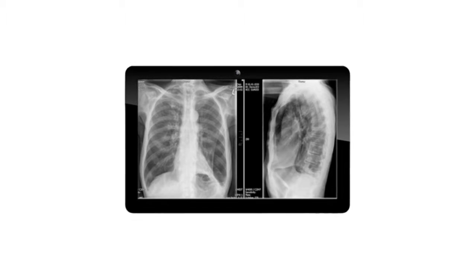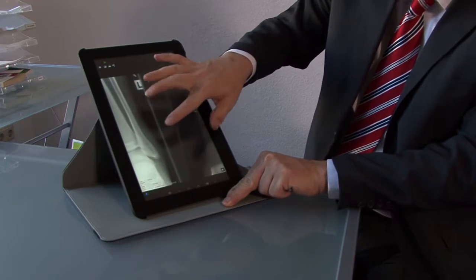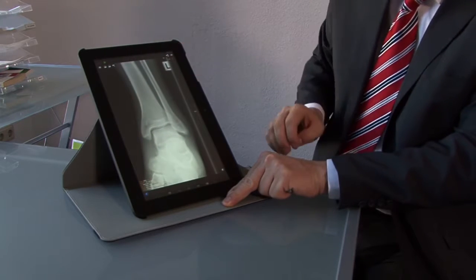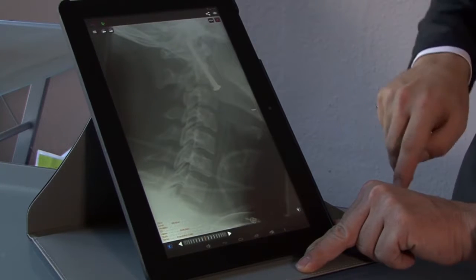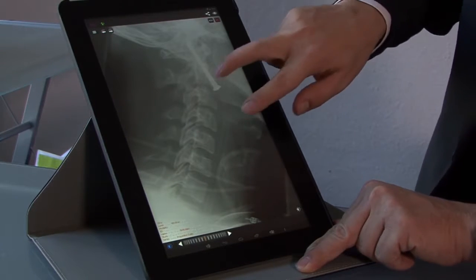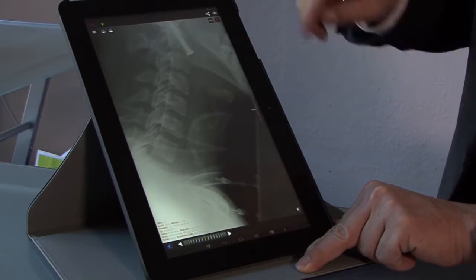We've worked according to the DICOM standard. We developed a so-called application-specific integrated circuit doing this kind of calibration. We patented it and implemented that into a tablet computer. A medical tool has different requirements, like it needs to be secure, it needs to be fast. According to German regulations, a medical display needs to have a diagonal size of at least 13 inch.